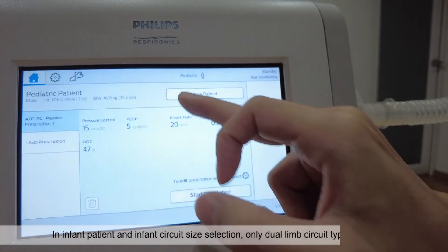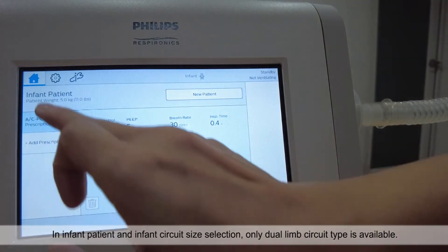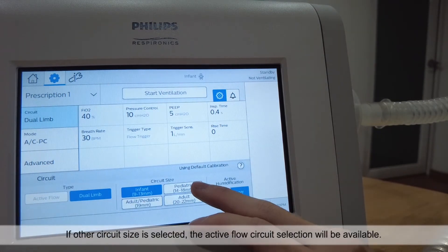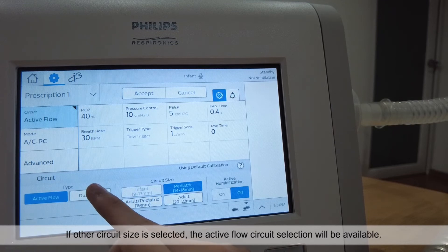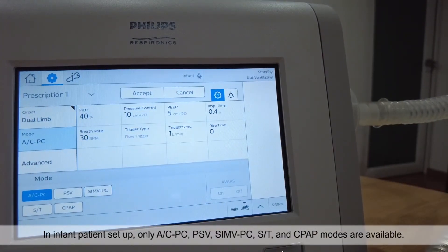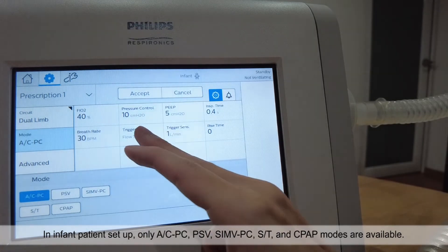In infant patient and infant circuit size selection, only dual limb circuit type is available. If another circuit size is selected, the active flow circuit selection will be available. In infant patient setup, only ACPC, PSV, SIMV PC, ST and CPAP modes are available.